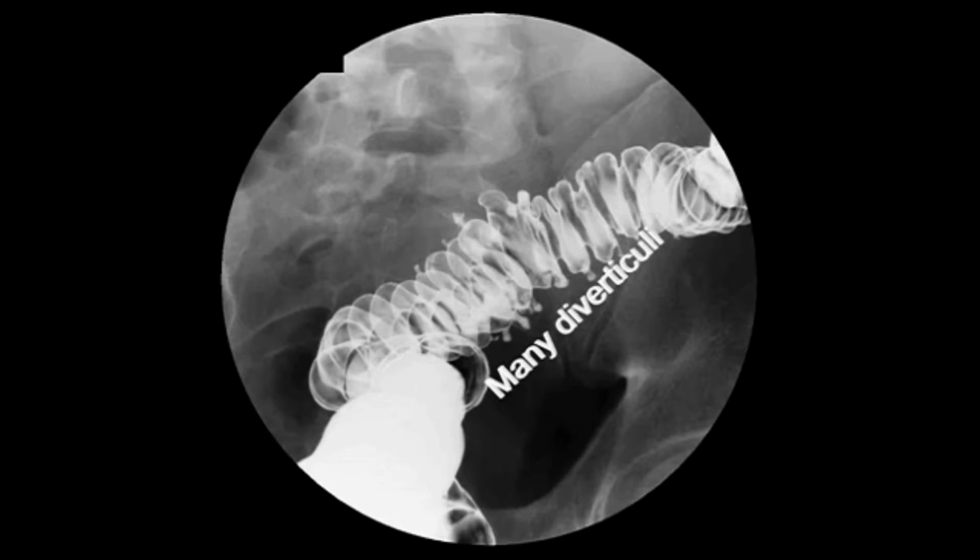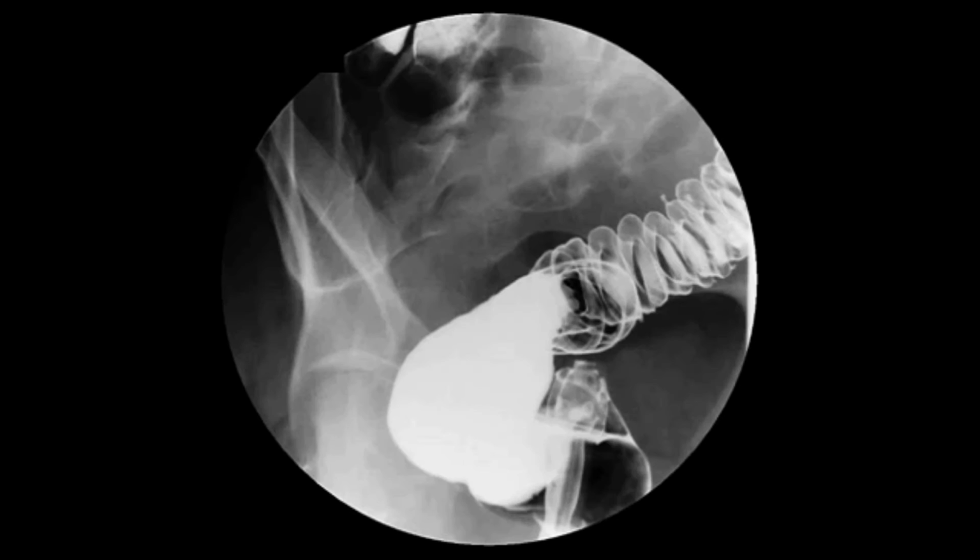Not only is the colon lengthy and redundant, the length differs from person to person, but we have to make it through several areas of diverticulosis and perhaps even other areas of pathology. Diverticuli, again, look like small pockets or small peas that have been glued to the outside of the colon when viewed on the barium enema exam. The barium enema is administered usually by instilling dilute barium into the anus and then inflating the balloon of the enema's catheter to help the patient hold and not expel the barium.